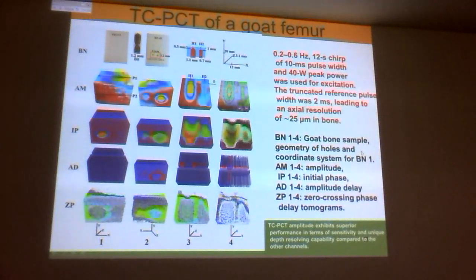That's what it's doing. So this turned out to be just right because of the thickness of the sample as well as the thermal profile. The thermal profile in bone is such that the diffusivity is low. That allows you essentially to keep yourself going into the medium for quite a certain amount of time, and then you can see a certain depth.